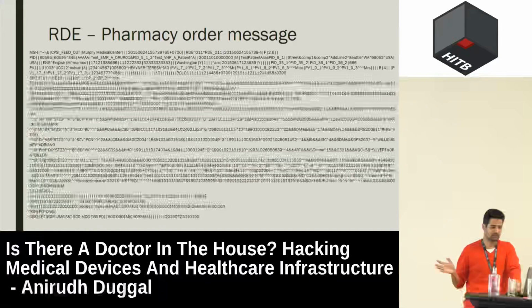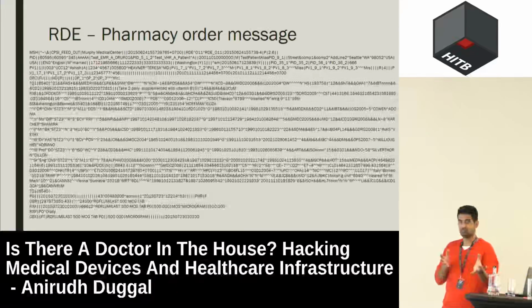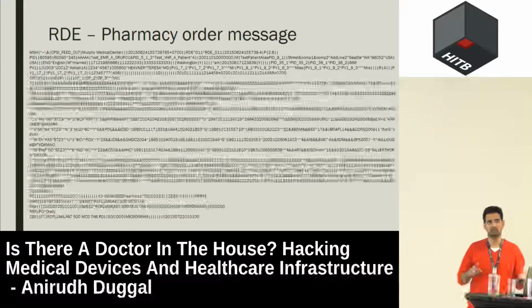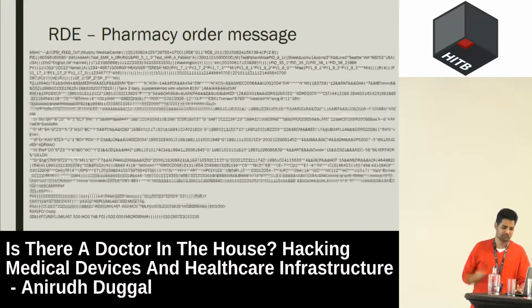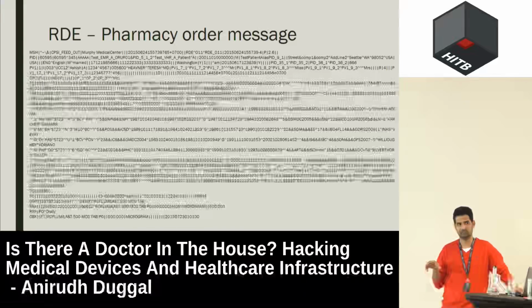This is the pharmacy order message. I'm sorry for making it really boring, but we'll see demos after this. But this is important, when you refer to these slides and when you look at pen testing hospitals, this is what you need to refer to. So this message is sent when you need to dispense medicines.